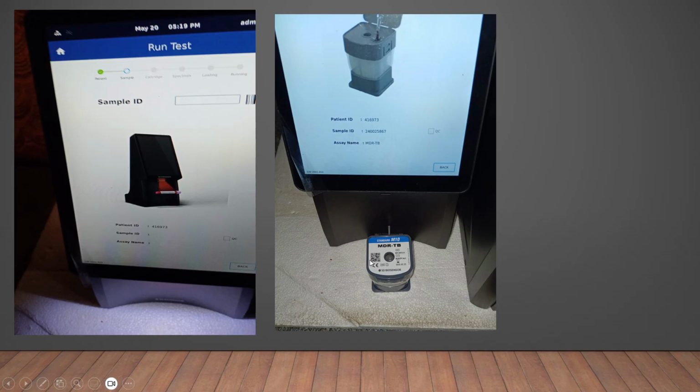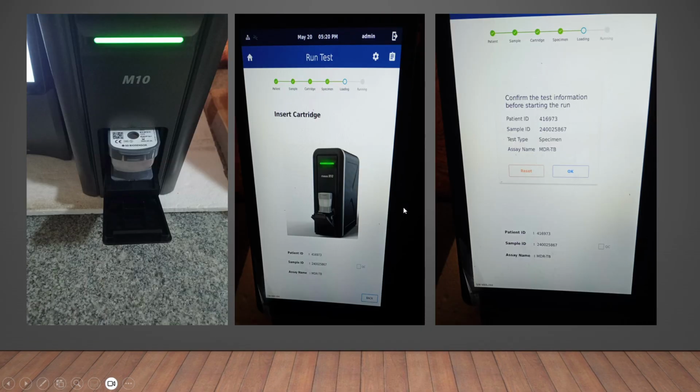So, which cartridge you are using, this barcode, the QR code that is present, has to be read below the instrument. There is a barcode reader that will be able to read it. Now when you are giving the patient ID on the instrument, this door would have opened already. It will always open. Be careful not to keep the cartridge in this part, because when the door opens it may hit the cartridge and the cartridge may fall. As I told you, once the seals are broken, the cartridge should not be tilted or anything like that.